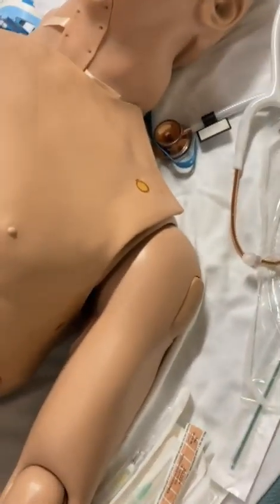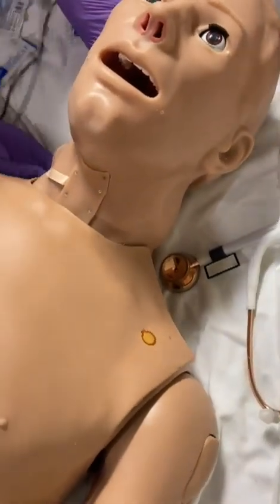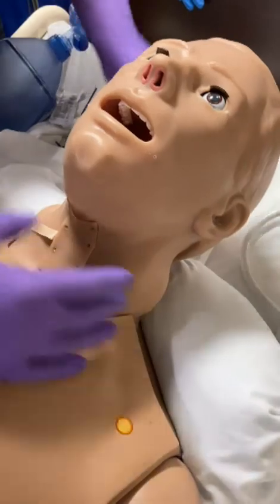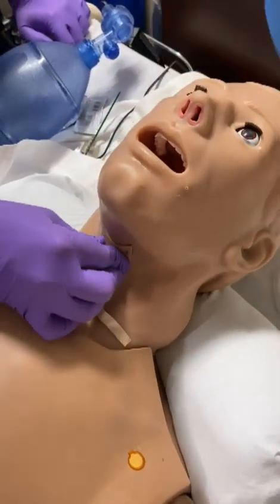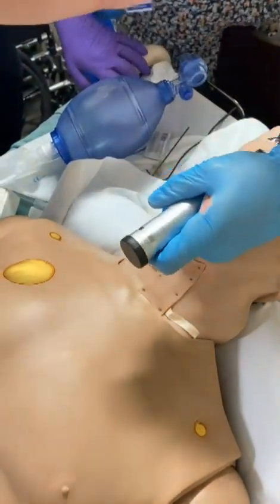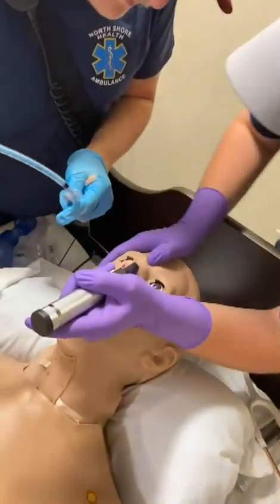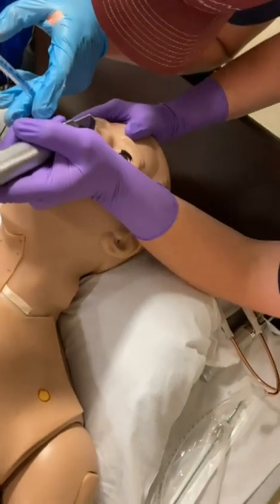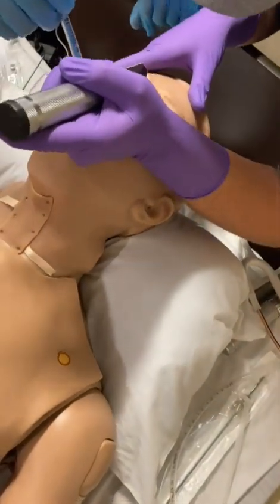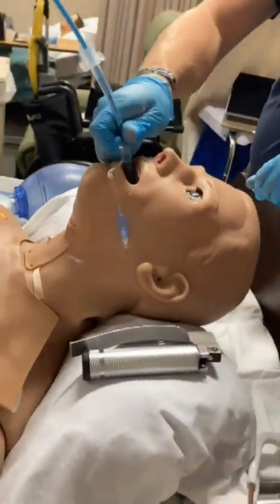Let's get down in their business — ramped. Let gravity do its work. You don't need to feel uncomfortable and get way down — let's make this go up. You can prop your patient: move the patient to what you need. I like them to be ramped up — go under the shoulders — because then I don't need to strain, and it's already a stressful situation. You should actually be able to do this with ease. You're going to try cricoid pressure — do your best. We're going to sweep, and do you see it before you stick? I see nothing.